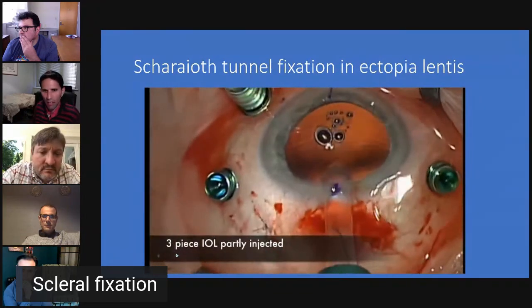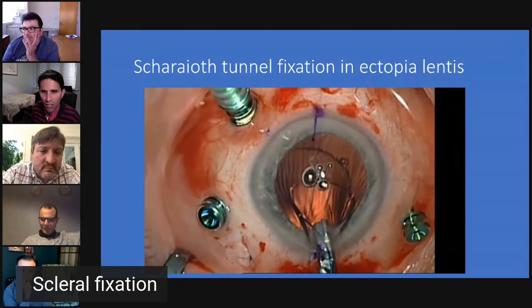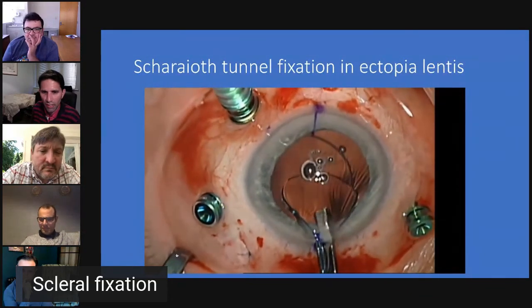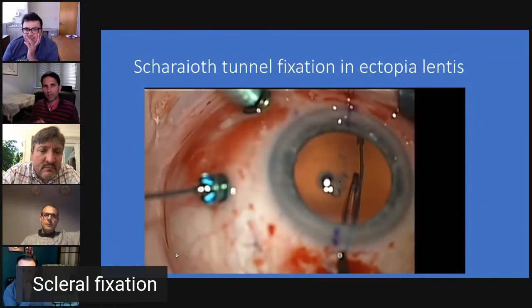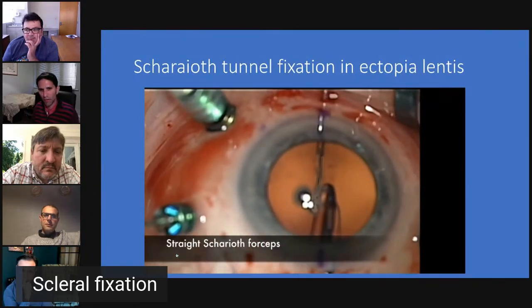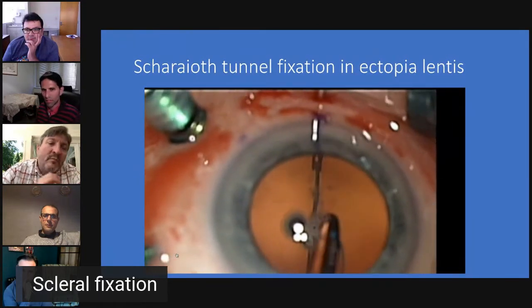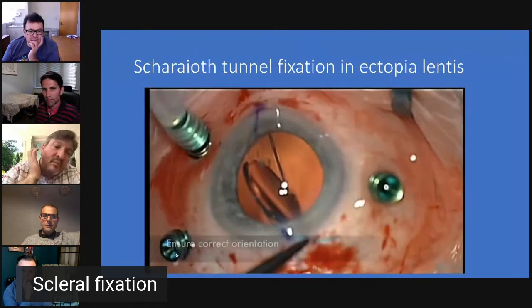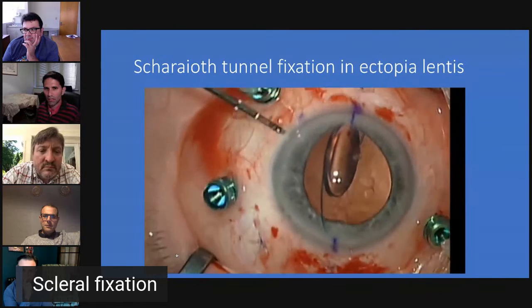And then this is a Sensar lens, which is a three-piece injected lens, partially injected into the eye, leaving a haptic just outside the eye so that you've got control of it. And you might see some forceps there inferiorly, these are straight forceps, grabbing the tip of the haptic, and then externalizing it through the sclerotomy.